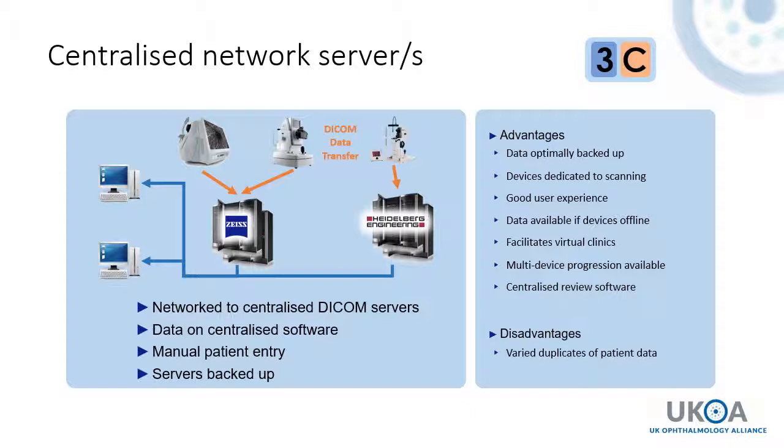So the scanners and cameras are dedicated to capturing, which they then do more efficiently because they're not acting as servers. And the experience on the PCs in the consulting rooms is better because they're being fed data from dedicated servers, so the software tends to be more responsive.